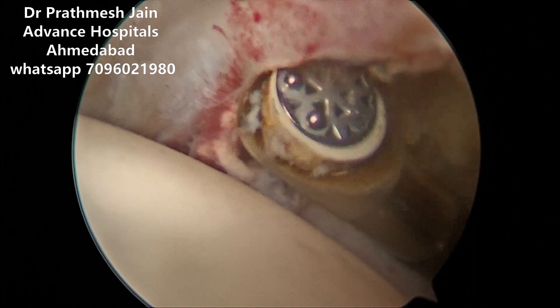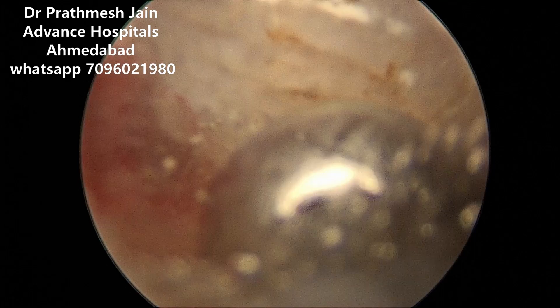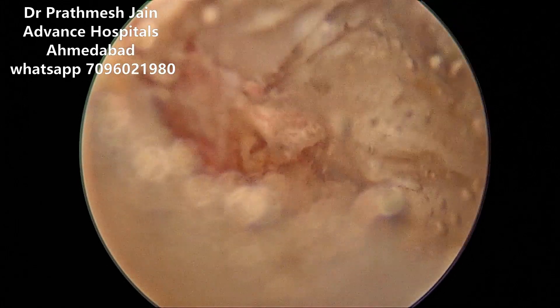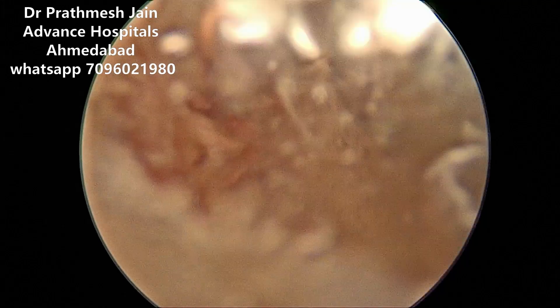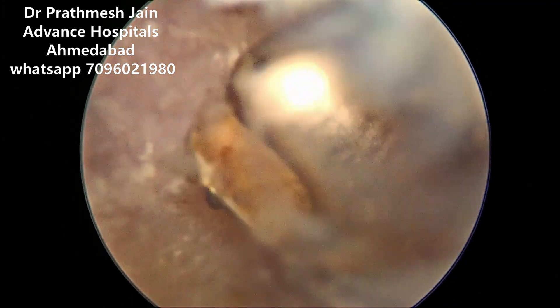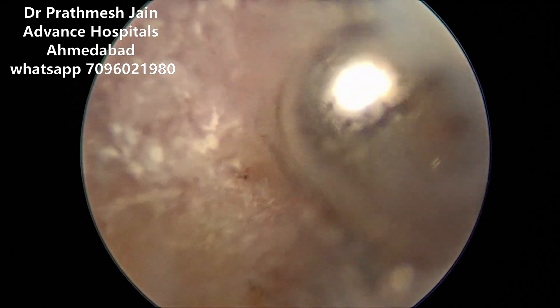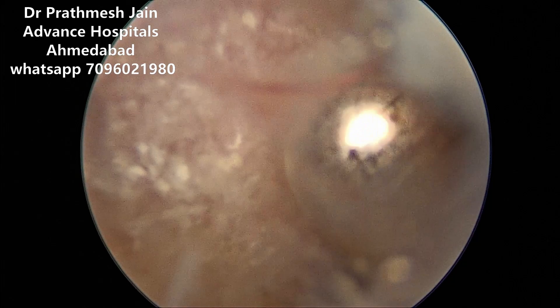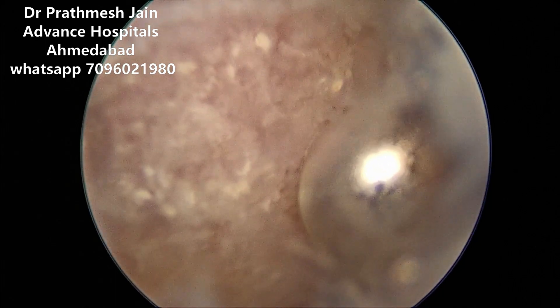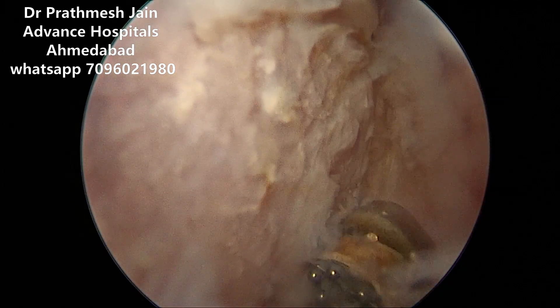There may be some bleeding points that need to be coagulated, but you can very nicely see the iliopsoas muscle here. This is the region of the CAM lesion, which needs to be demarcated nicely with the radio frequency device initially. After that, once you have done this thorough demarcation of the extent of your resection — superior, inferior, medial, and lateral — you can then use your burr and shaver to do the CAM resection.